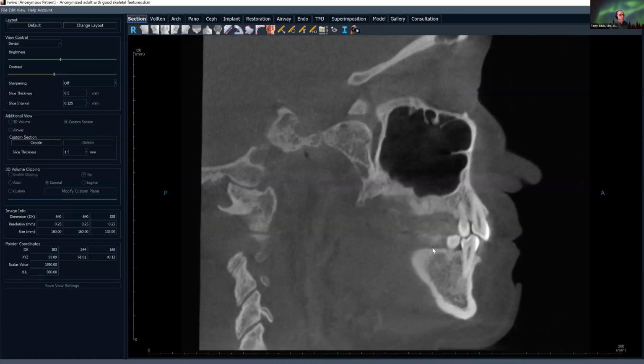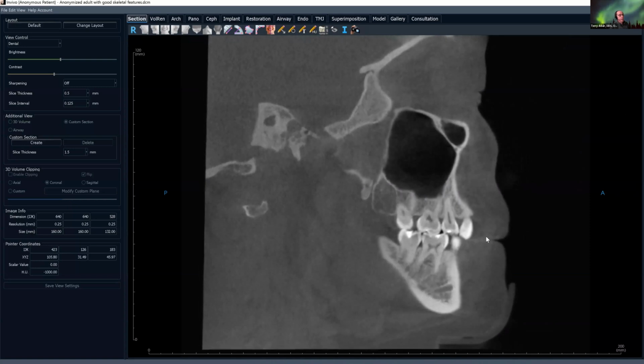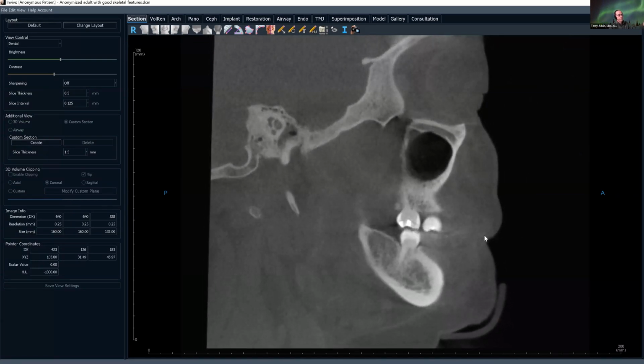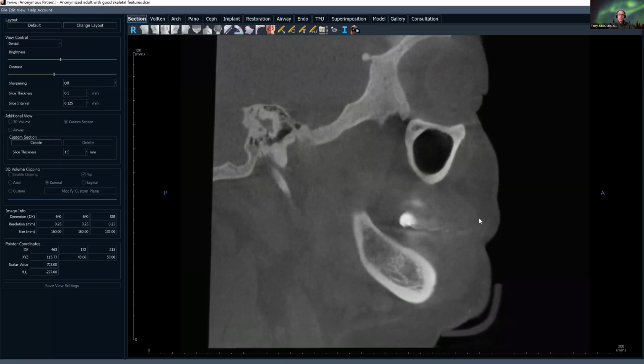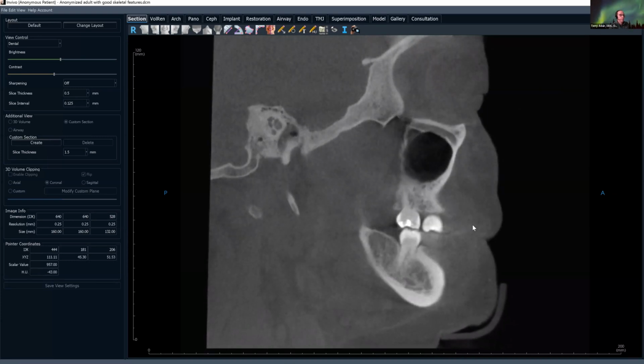Then I go to the sagittal view. I start on one side or the other. Typically, when I've gone through my scan, my cursor was left on this left side. I go until all the teeth disappear. If they're third molars, I want to see them as well. I'm starting from the patient's left. We've looked at everything else, so we can focus just on the teeth now. And this is our area of expertise. We don't want to miss something here.